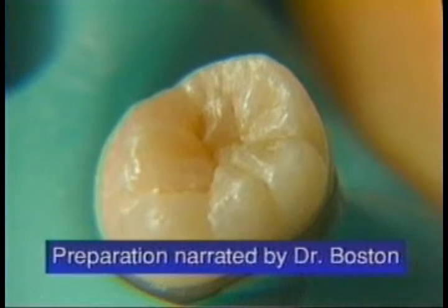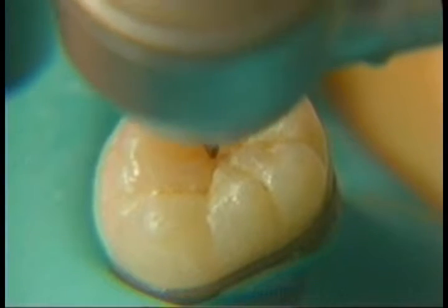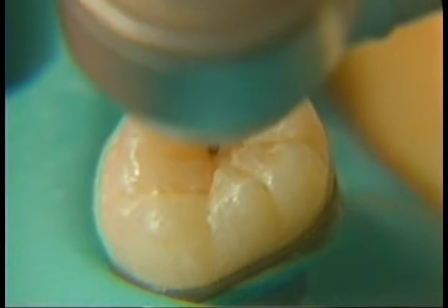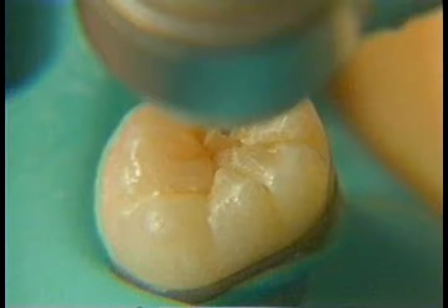You can see the depth of the fissures and some subsurface staining in this area. We'll go in and explore that for the presence of first enamel caries and what I suspect will be dentin caries in this area.